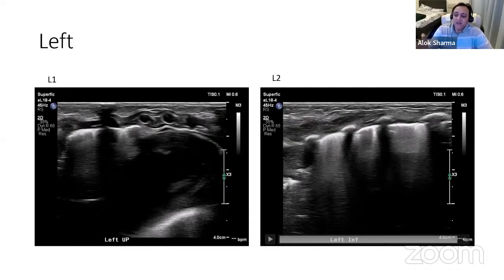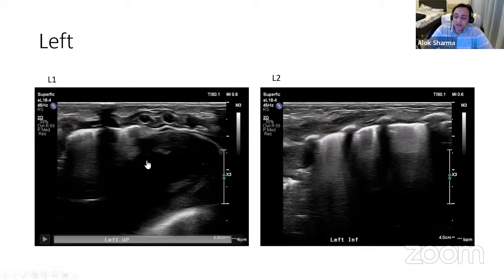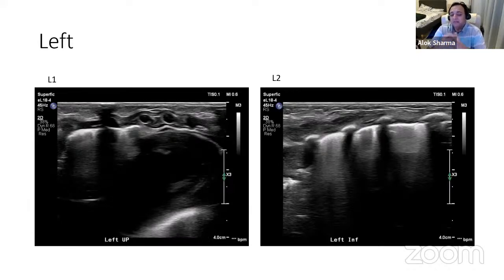What I would say is that if you do serial lung ultrasounds and your B profile is getting better and you're getting more aeration, hopefully that's an indicator that the interstitial fluid, that interstitial edema, which is probably there because a chemical inflammation has interfered with lung fluid absorption, is now getting better. That's the way I'd put it.